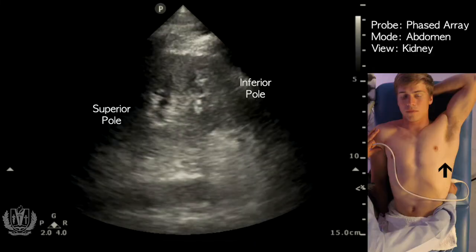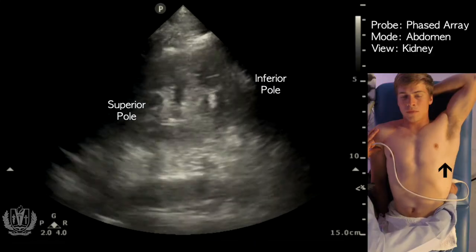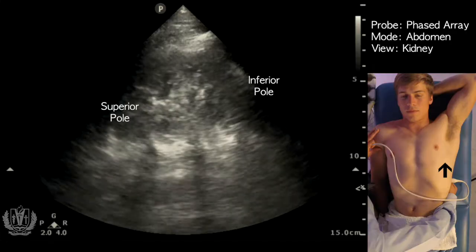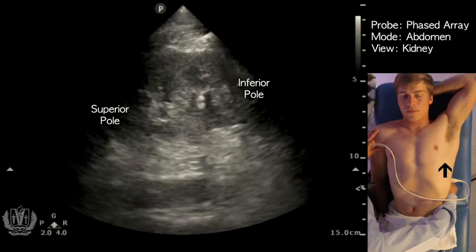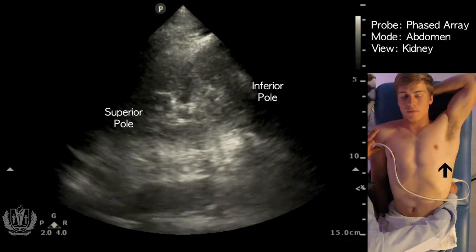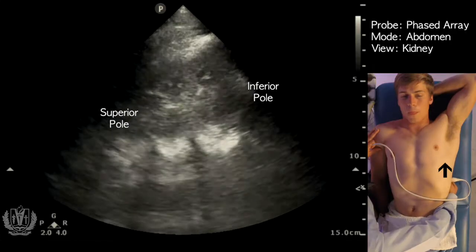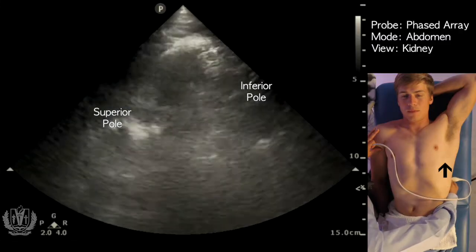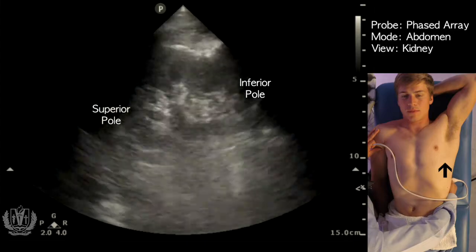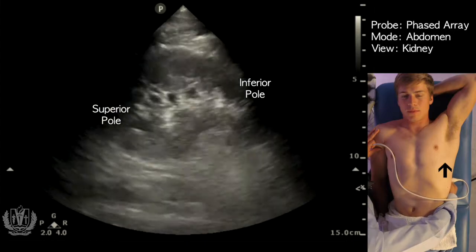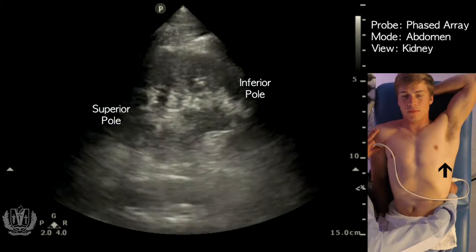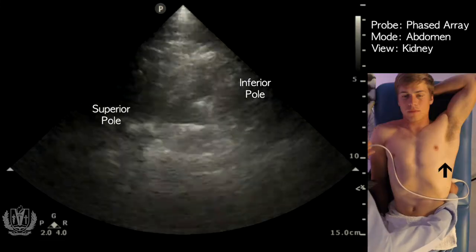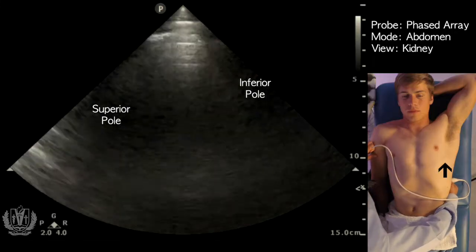Here you see the left kidney. Take a breath in and out — and you can see the kidney moves with breathing. The main thing you want to assess for with the kidney is hydronephrosis. You can't really see kidney stones unfortunately, but you can see indirect signs such as hydronephrosis and kidney size. Other things you can look for are kidney cysts on these views.